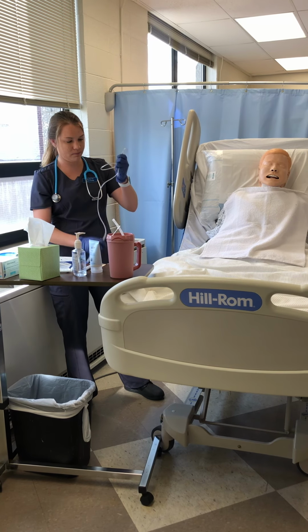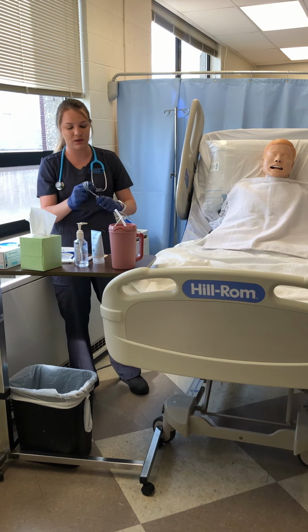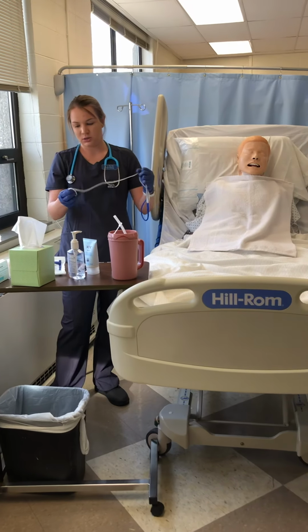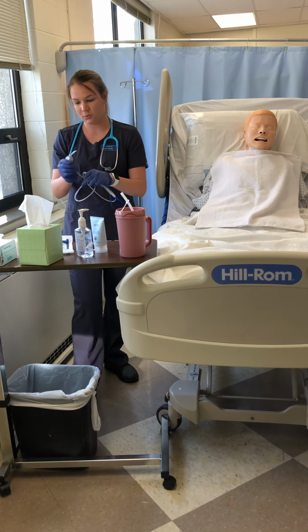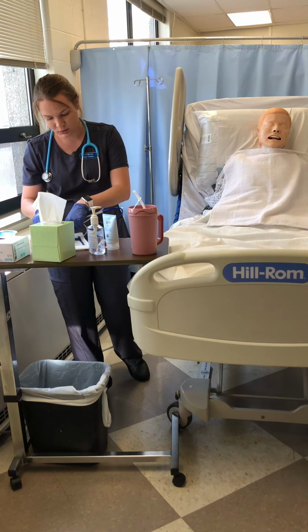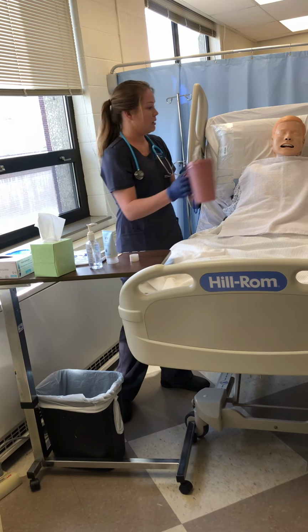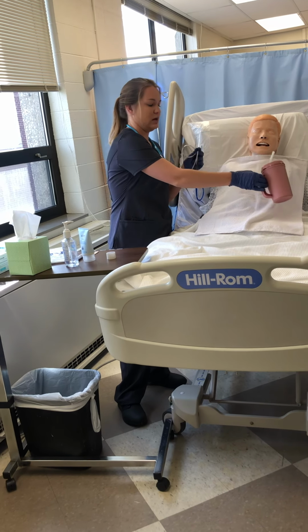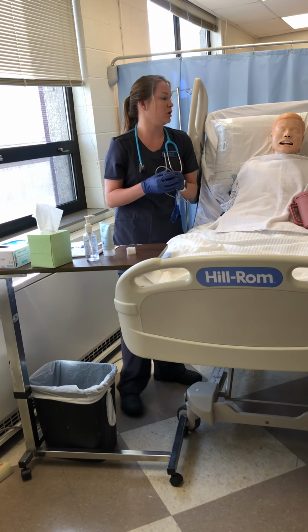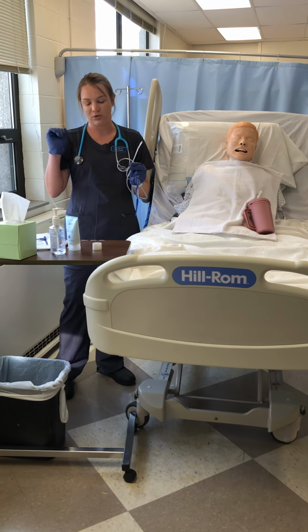And I'm going to wrap this around my finger about 10 to 15 centimeters to make it a little easier going into my patient's nose. And I'm going to lubricate it about 4 inches. I'm going to make sure my patient is able to swallow because I'm going to have him take some drinks after we pass the oropharynx. And I'm going to set up a communication so if my patient needs a break or needs me to stop, just have him raise his hand.